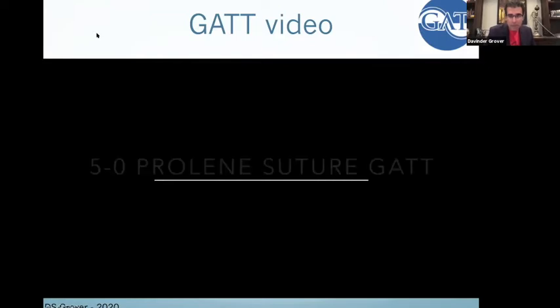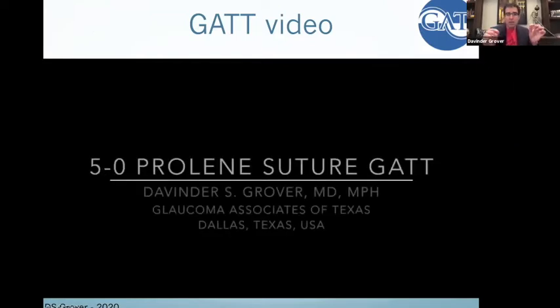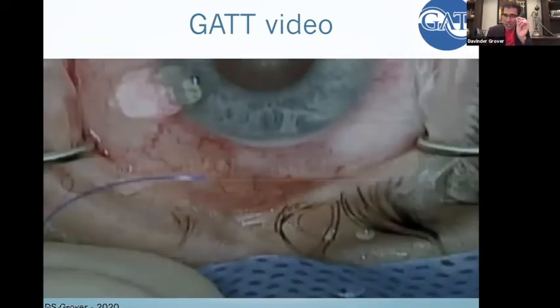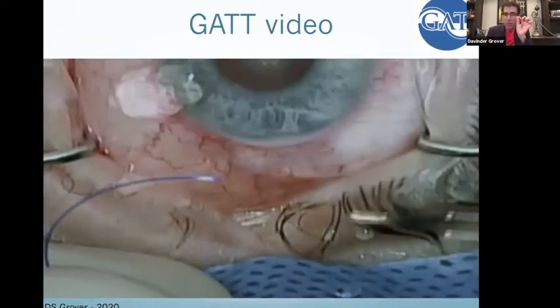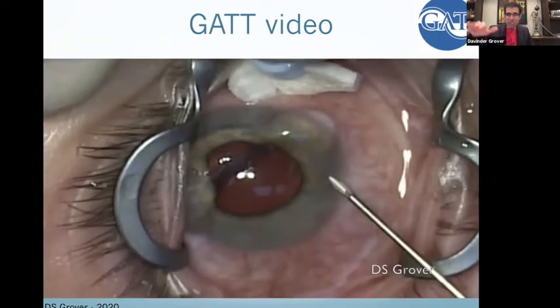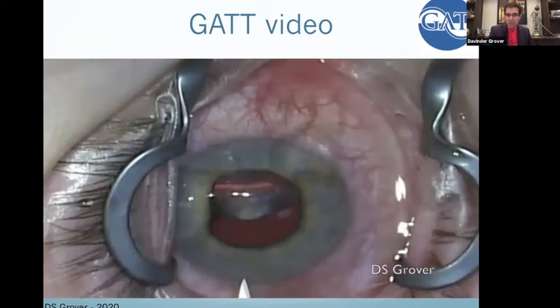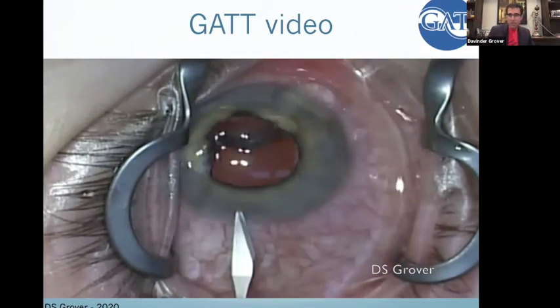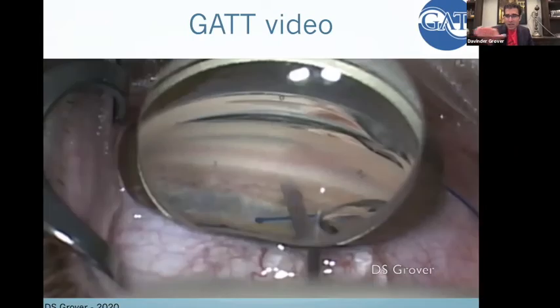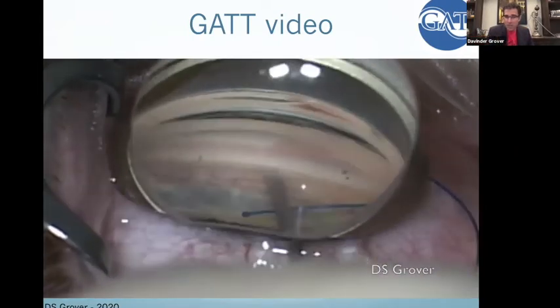So here's a video of it, and I hope the resolution is okay. Use a cautery, and you want to see the slightest change. You want to create the smallest bulb possible. And here I'm doing a 23 gauge needle. Now I actually just do a paracentesis and a paracentesis with the same blade, a 15 degree blade. And then this is an MVR blade. You can also do a 23 gauge needle.